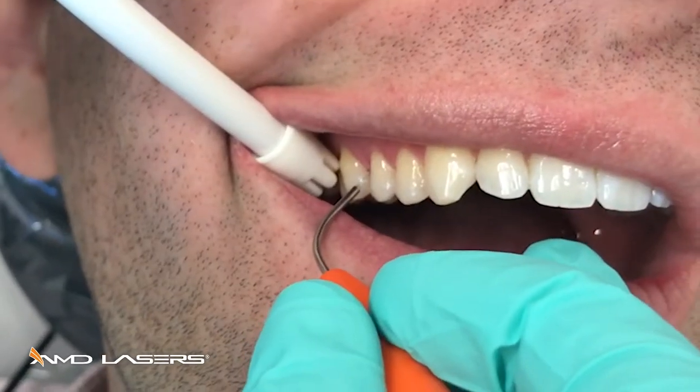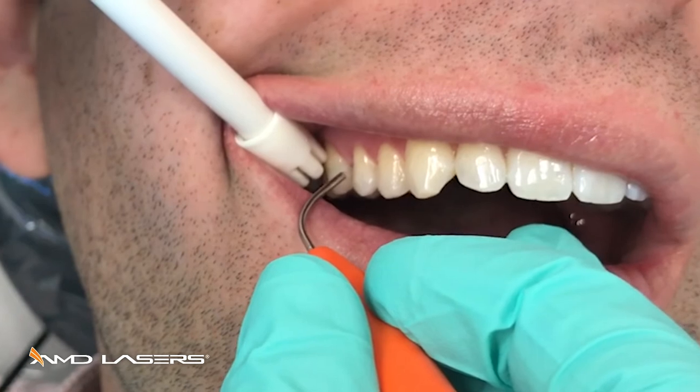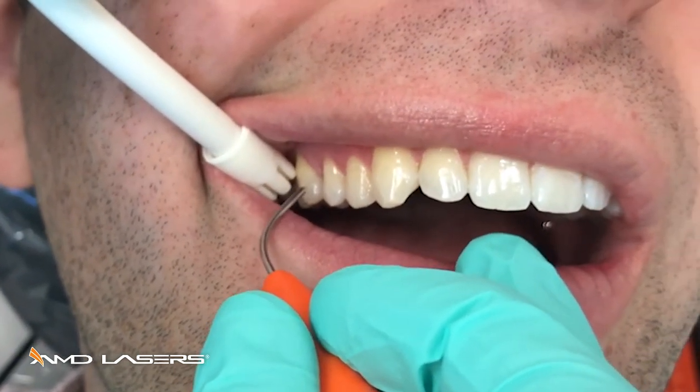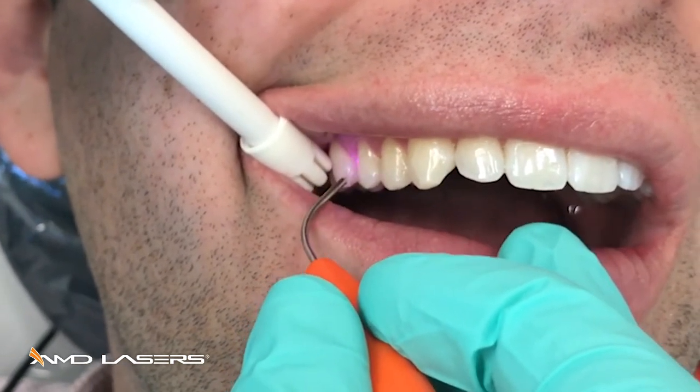What I want to do is go to the depth of the pocket, find the deepest area of inflammation, then back up about a millimeter, start my movement gently against the tissue, and then fire for a few seconds.